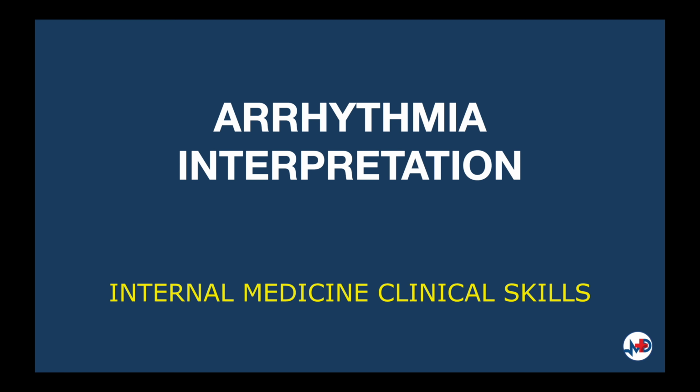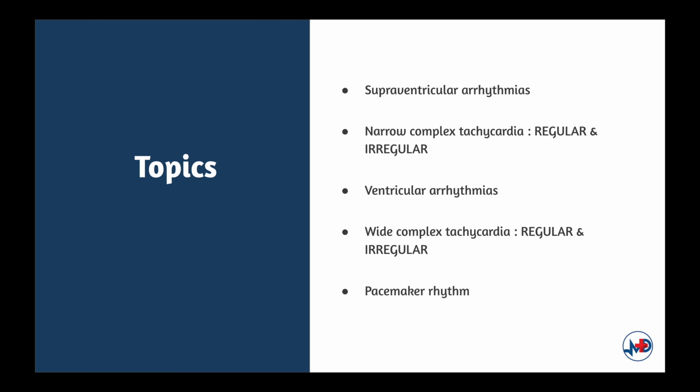Hello and welcome to the Arrhythmia Interpretation in Internal Medicine Clinical Skills. The topics that will be covered here include supraventricular arrhythmias. We'll be looking at narrow complex tachycardias, which are regular and irregular, ventricular arrhythmias, wide complex tachycardias, which are regular and irregular, as well as pacemaker rhythm. Let's get started.